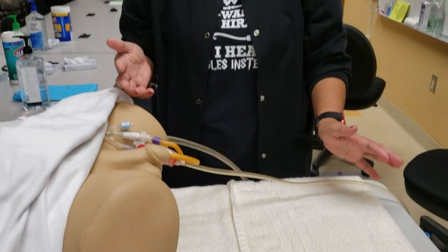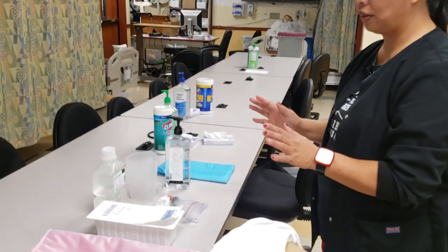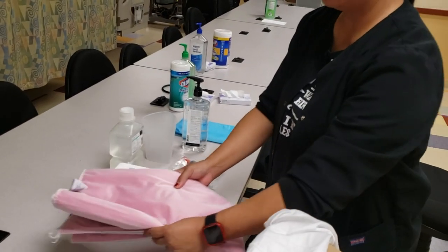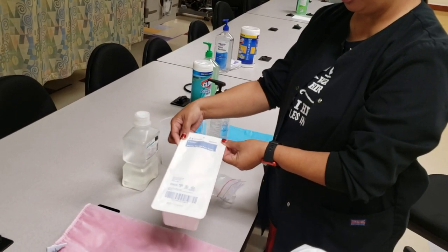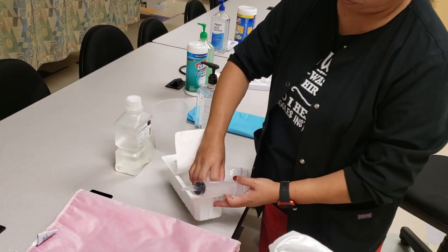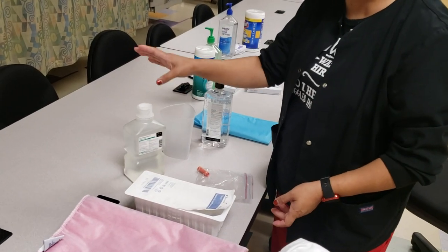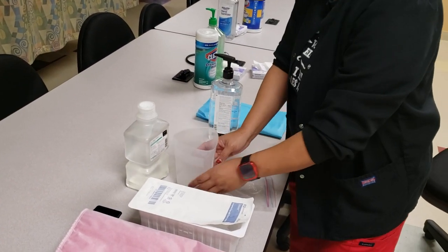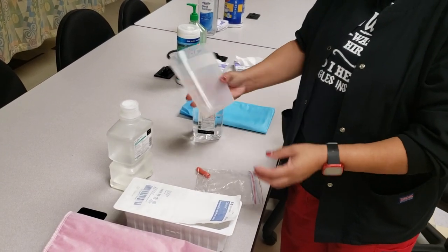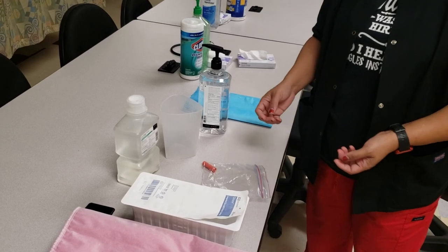If the patient is bleeding heavily and clots are starting to clog the system, we need to clear those clots — that's the procedure I'll demonstrate. First, gather all supplies. You'll need chucks because this is a messy procedure, an irrigation tray with a piston syringe, and normal saline.